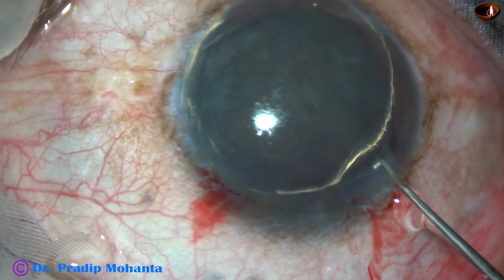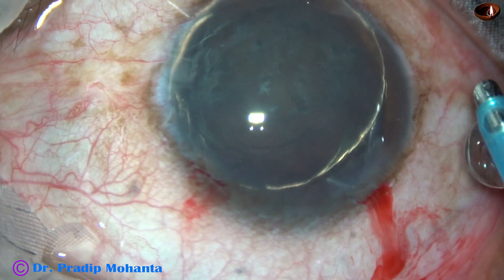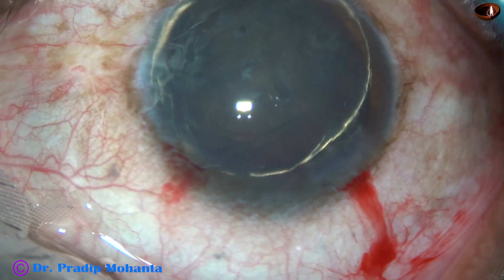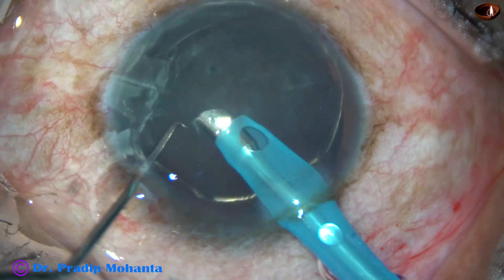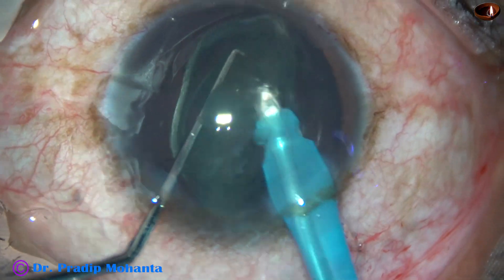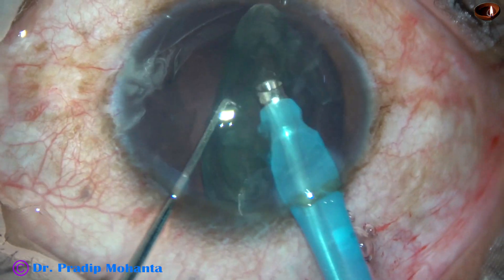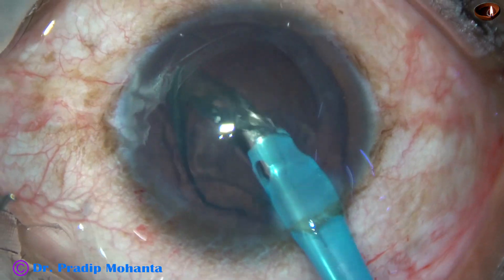But we must not emulsify it in the anterior chamber. Let us observe this surgery from now on. I am going to emulsify this lens mass at the iris plane. So I support the lens, tilt it, and the lens matter is eaten off at the tilted position at the iris plane. And it is done.